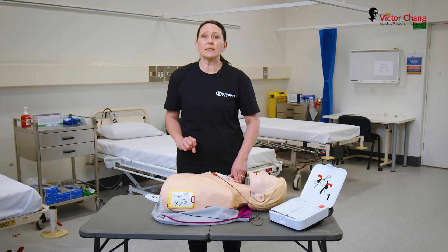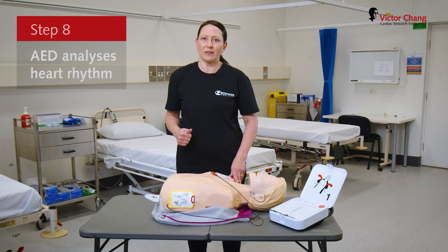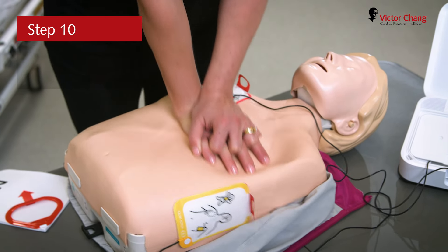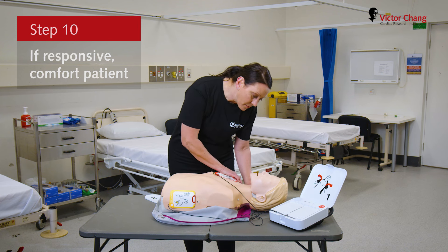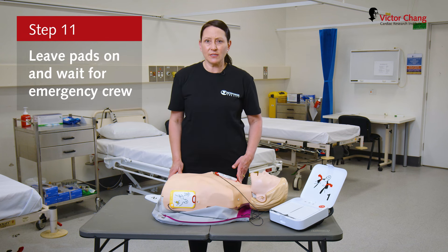After two minutes of CPR, the defib will stop and analyse that person's heart rhythm again. If the shock was not successful, we'll need to continue with CPR. If the shock is successful, you'll notice that the person is now responsive — comfort them, leave the pads on, and wait for emergency services to arrive.